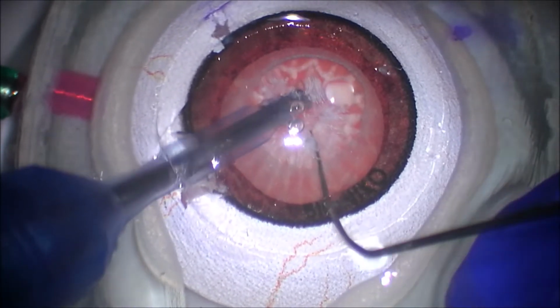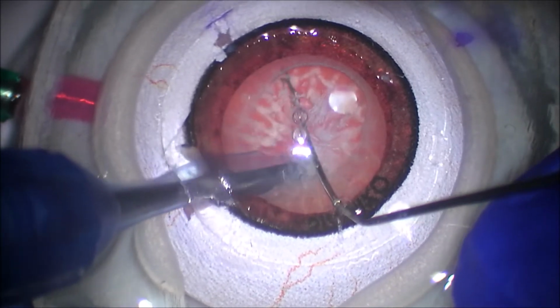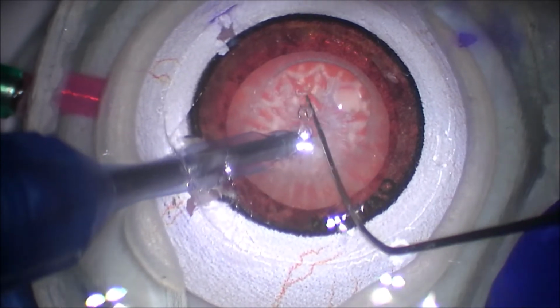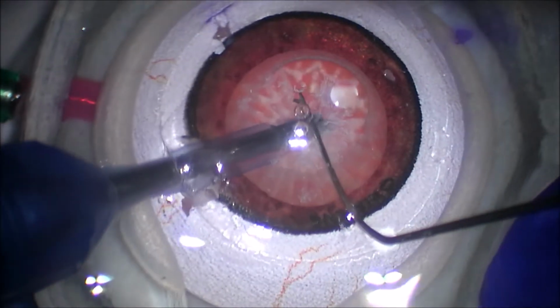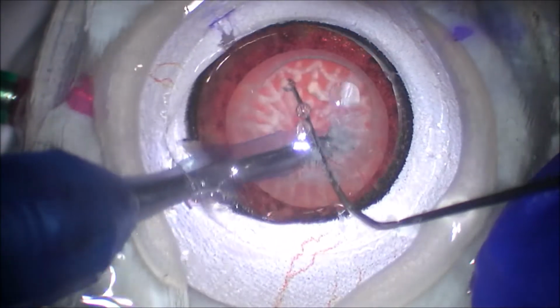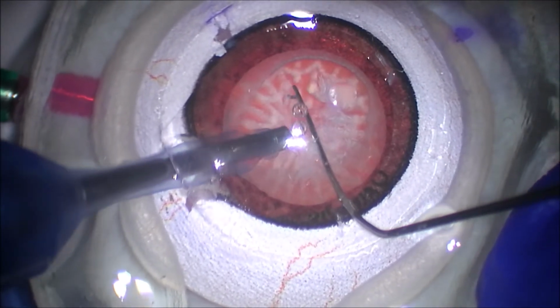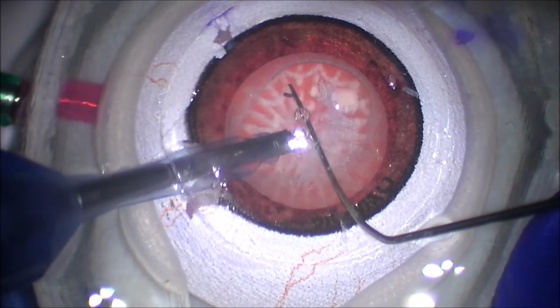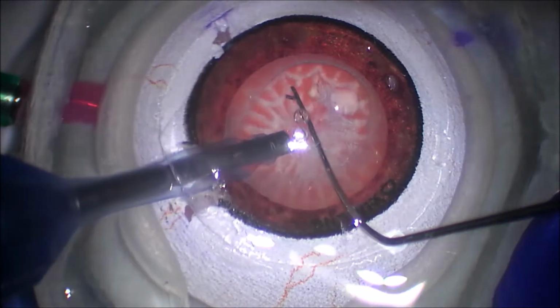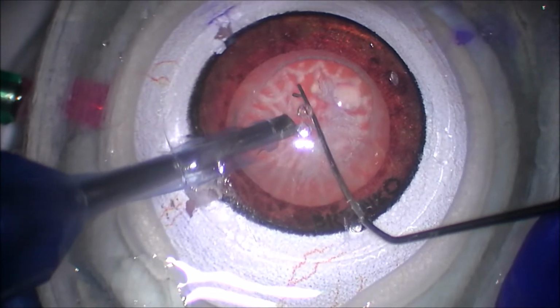And you can see here she's trying to crack. She has a Maltzman instrument here, which is really, unfortunately, the only instrument we had while we did this. We were doing this late in the evening at the operating room by ourselves, along with the other medical student. And so this instrument is actually pretty good, the Maltzman, for spinning a free lens. Not quite sure it's really ideal for cracking.